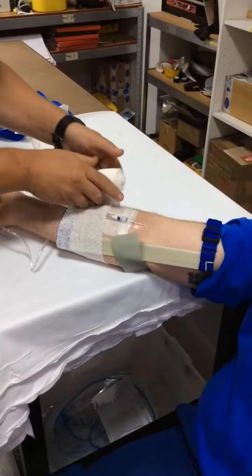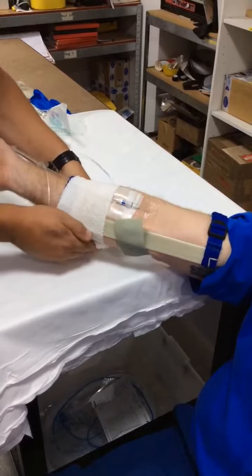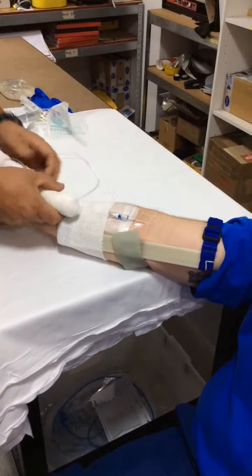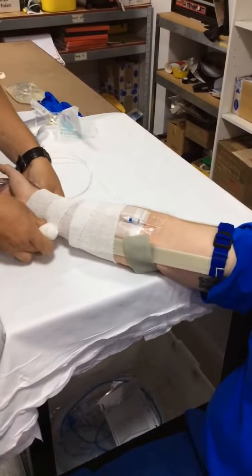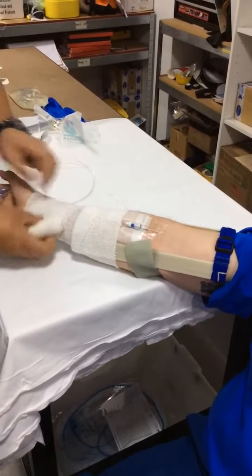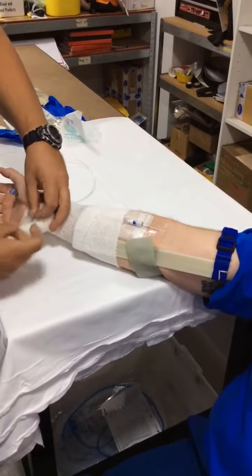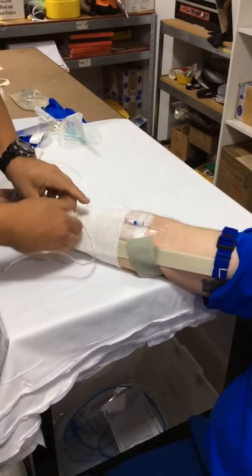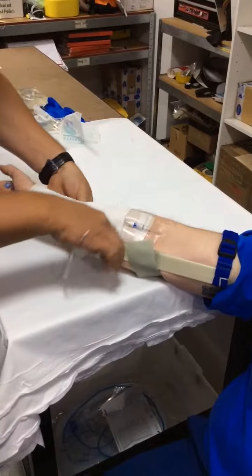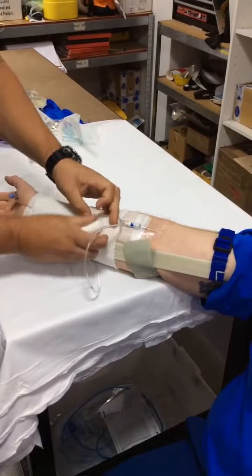You're not hiding the access point. Come down, follow the IV access down to the hand, then come back up the arm to your starting point.